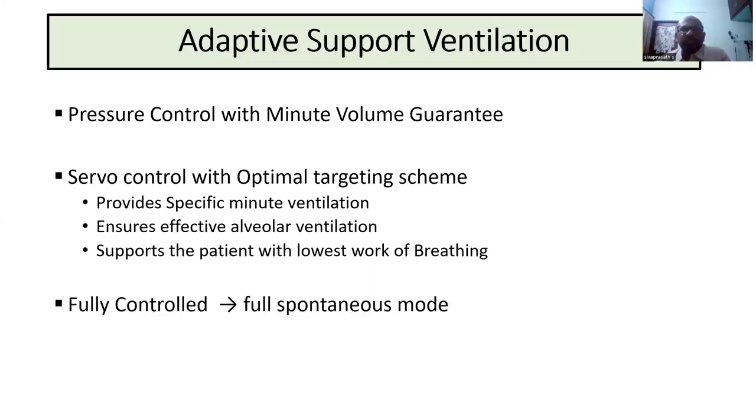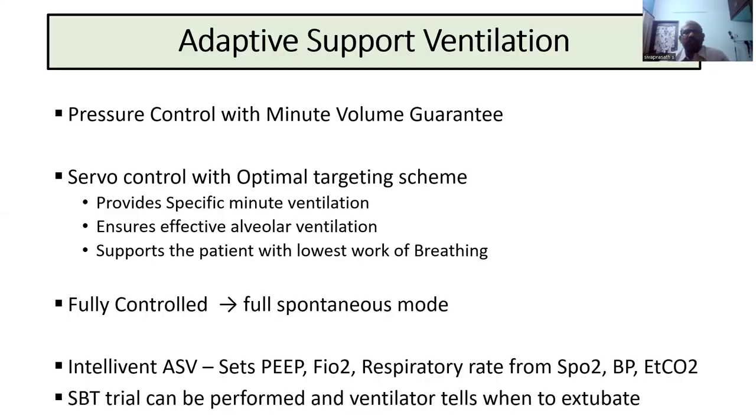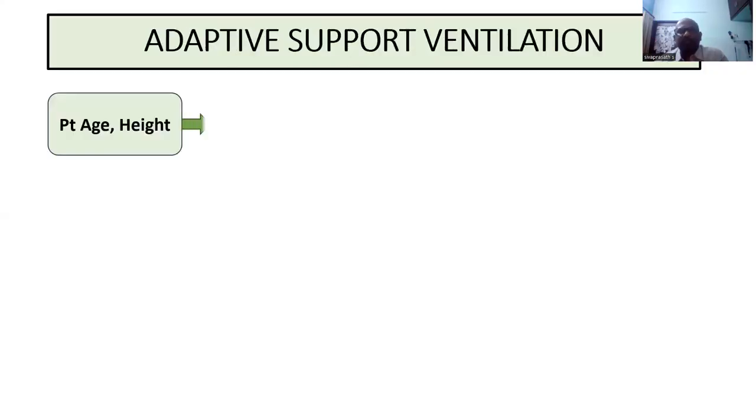It can function from fully controlled, when the patient has no effort at all, to a fully spontaneous mode. And as I already told you, you can set PEEP, FiO2 and respiratory rate from other variables obtained from other monitors like SpO2, BP, end-tidal carbon dioxide. With that, it can set PEEP, FiO2 and respiratory rate. So it becomes a totally automatic mode. And even a spontaneous breathing trial can be performed, and the ventilator will tell you when to extubate.